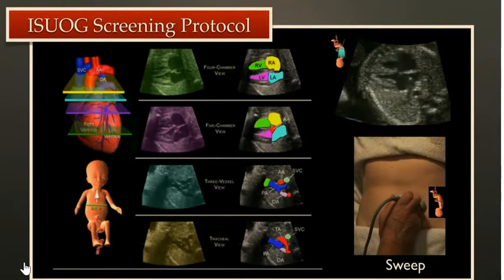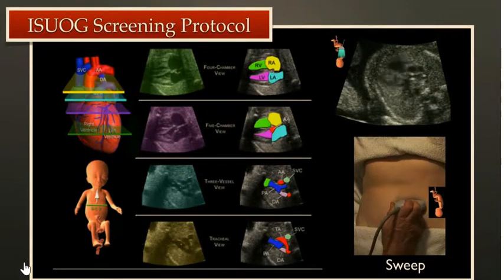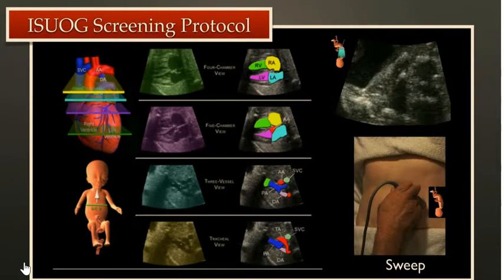This illustrates the image of the sweep and the movement of the transducer on the maternal abdominal wall. This imaging approach is the foundation for much of the discussion that will follow in this presentation.